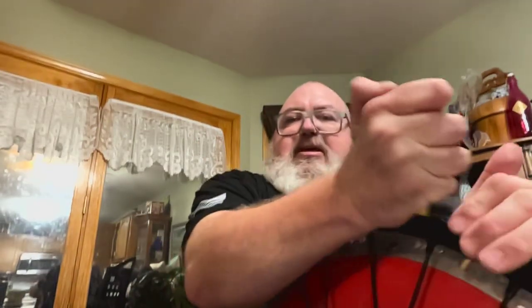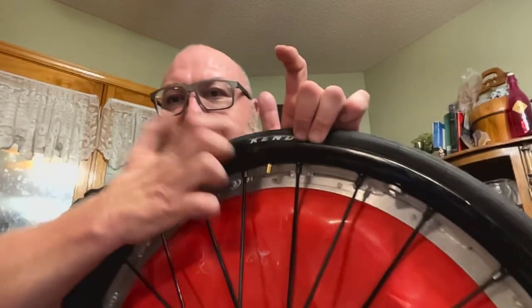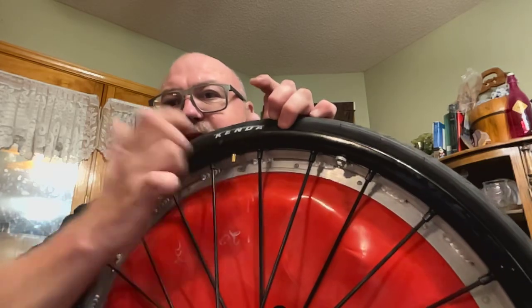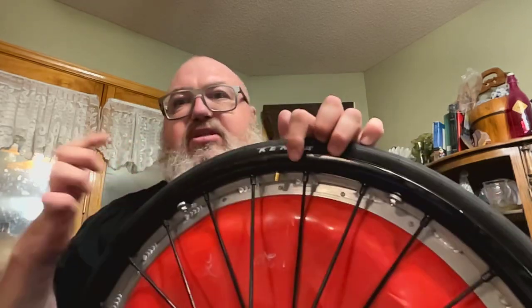And again, I'm pushing it until I hear and feel it snap in. It just snapped in. One thing I will tell you, see how it says Kenda? I always line up Kenda with the valve stem. So when I'm looking for it quickly, I can find the valve stem and go.